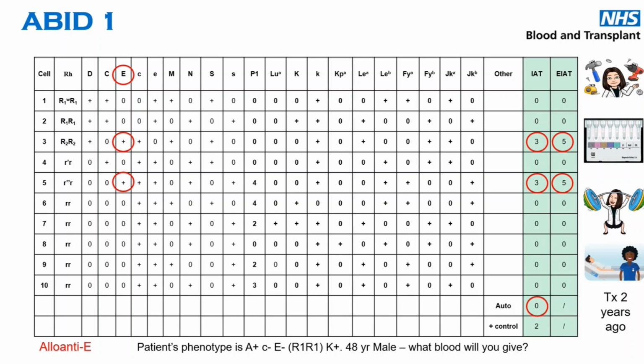And again, just always think, right, I've got my antibody, what tools do I need now? So you need to know your patient's phenotype. A lot of the time it's done by automation, or you could do it manually. And it's just having this understanding here. So we've got what IAT, it's looking like a big E, and you would know that RH is enhanced. And when you're looking at your PAPAIN treatment, RH is enhanced by PAPAIN treatment, which kind of confirms that it's a big E.